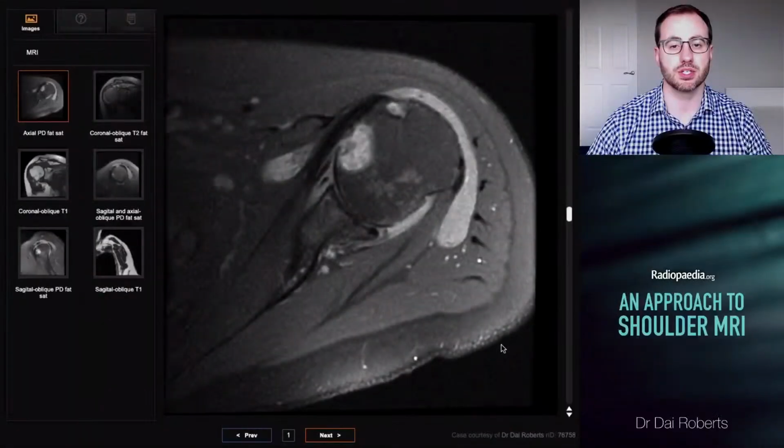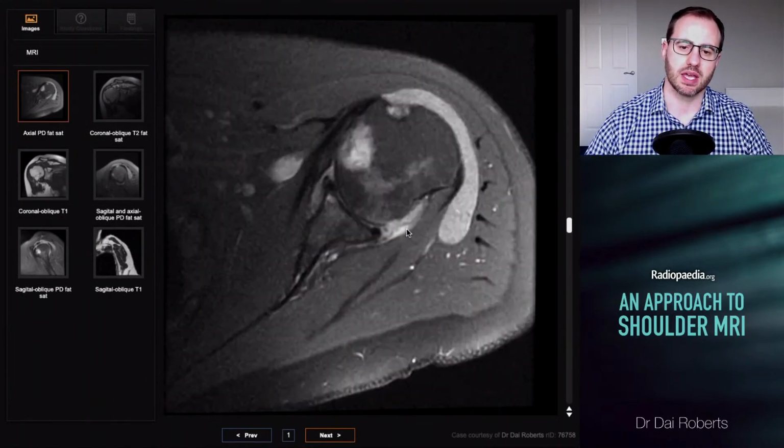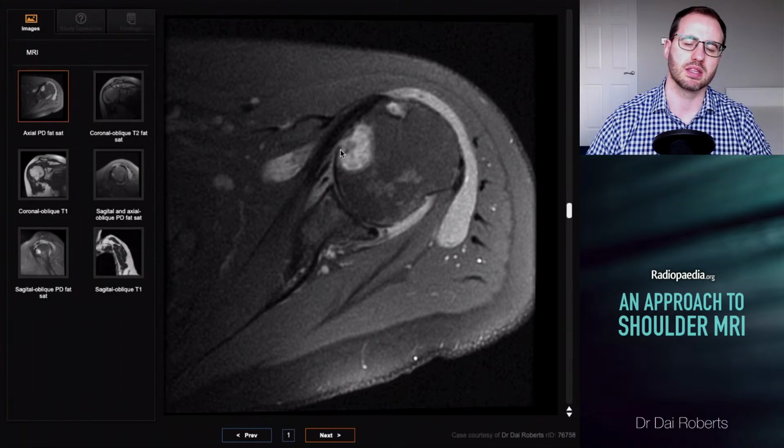Now, systemic conditions can occur in the shoulder joint, and this is a case of probable rheumatoid arthritis, and it's got some fairly classic appearances. It's read the textbooks, so to speak. So this is our bare area, this juxta-articular position. We've got the articular cartilage here, which is the hard surface, and then in these inflammatory arthritis cases, it tends to occur in the softer bone. You've got fairly good erosion here, and the bursa is massively distended, isn't it?